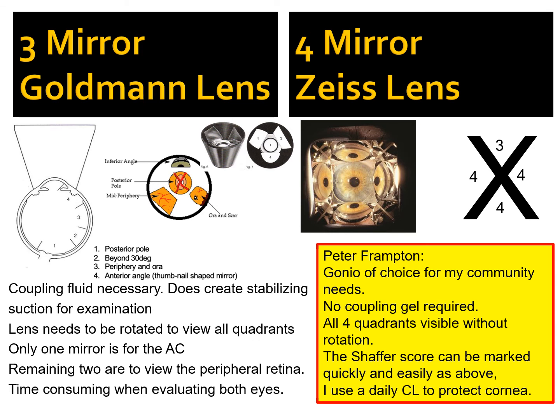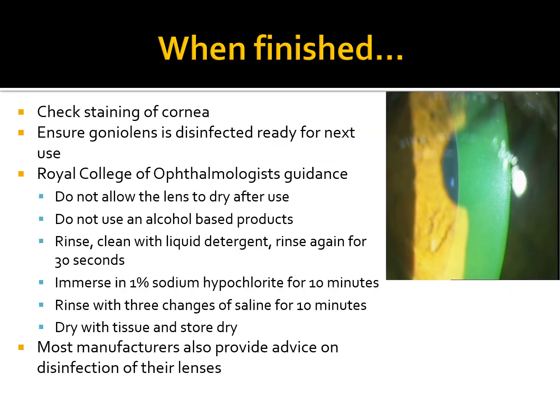And okay, CJD seems to have died a death recently, but you know, it's still out there, and there are still other bugs that can get in. So you've got to be thinking, you've got to be doing this risk-benefit analysis to figure out what you want to do.